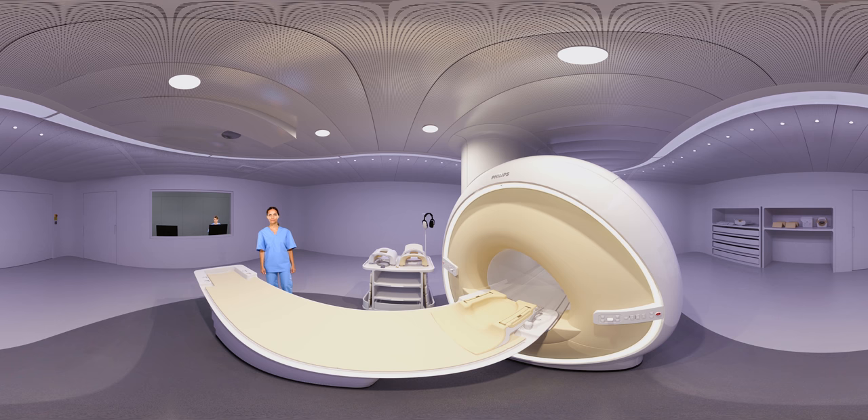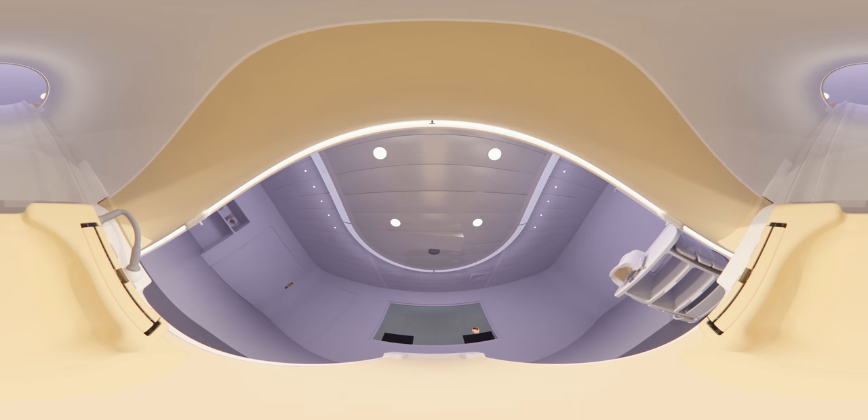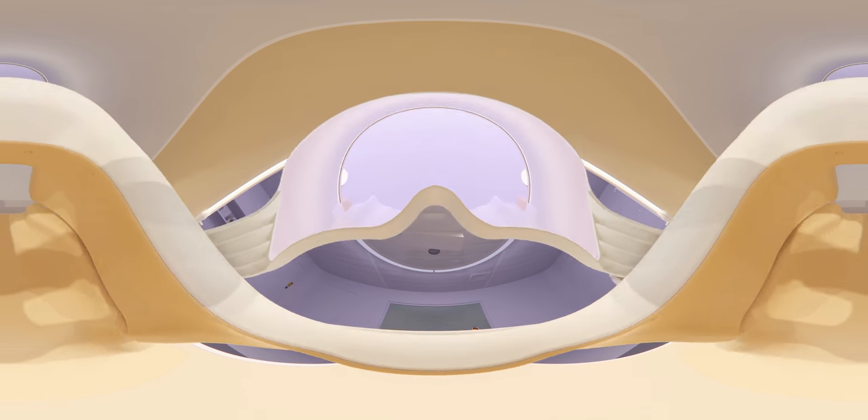You will need to lay down on your back and remain still during the examination. Otherwise, the images might look blurry. It's not always comfortable to lie still for a long time. The operator will place headphones and a head coil over your head. This is necessary to ensure the MRI scan images are of good quality. A mirror lets you look outside the scanner.